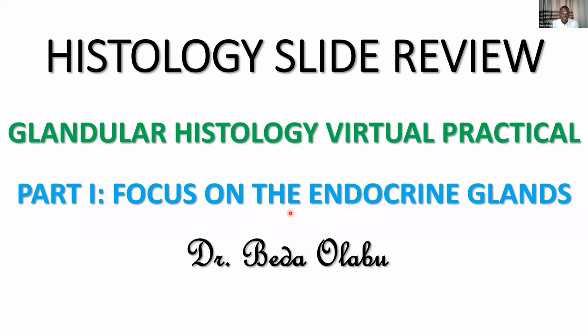Now, this is not going to be a lecture. You have already done the lectures, and my assumption is that you've gone through those 3 lectures that I shared with you earlier, because this one is not going to be a lecture of the endocrine system. It's going to be a practical. So it will be more of focusing on how to identify histological slides of endocrine glands on a microscope.